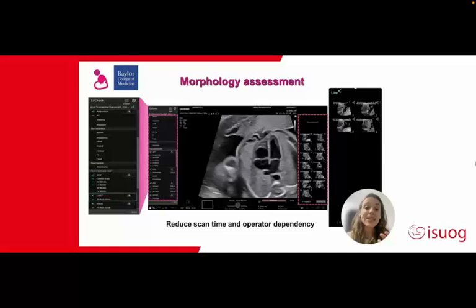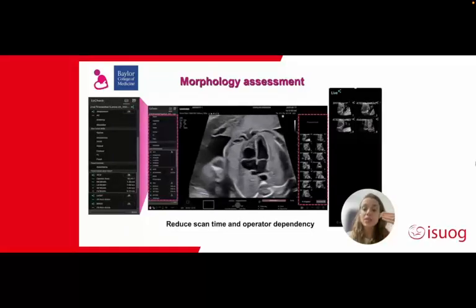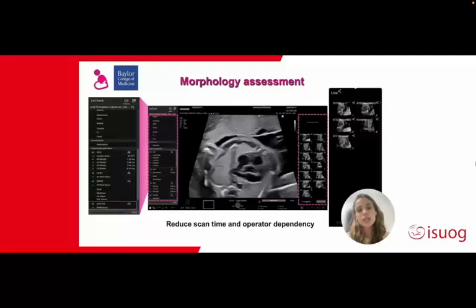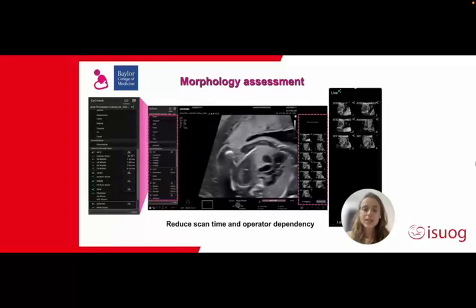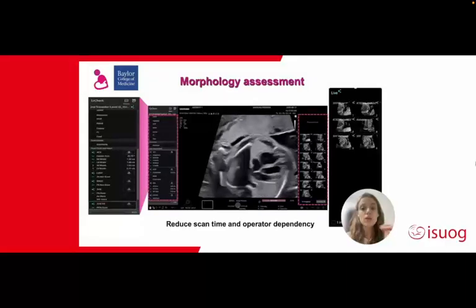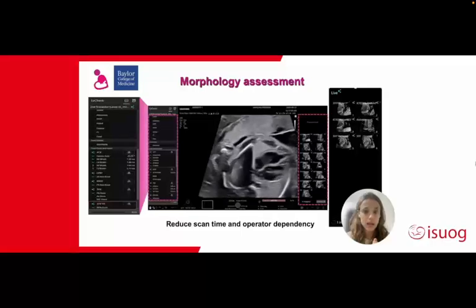So it will be getting the best possible image. And I don't know if you realize, but some images were being replaced because when one image has been acquired, but there's another one, a second one that comes that is better, then it is replaced automatically. And at the end of our scan, we just need to scroll down and review all of them, discard the ones we don't want, and accept the ones that we are happy with.